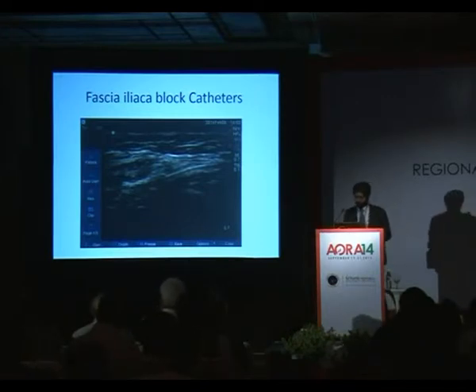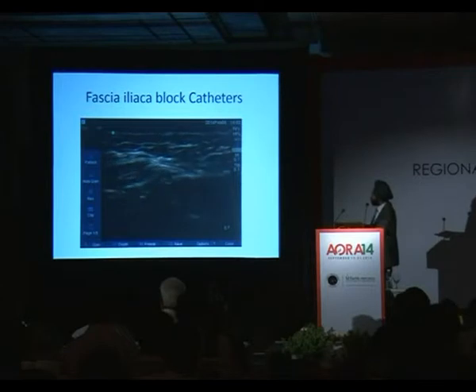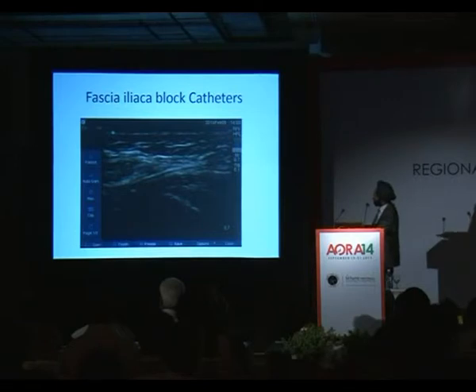So this is a patient where I've just done a catheter. I've already put about 30 mils of local anesthetic, and you can't see any local anesthetic because it all descends with gravity towards the lumbar plexus. And we can see our ilium here and the catheter sitting between the iliacus and the internal oblique.